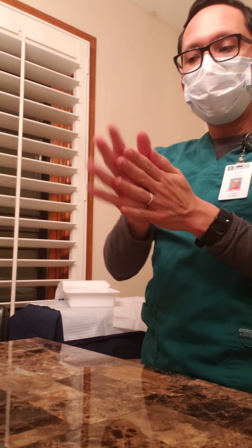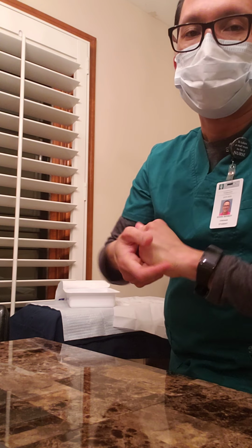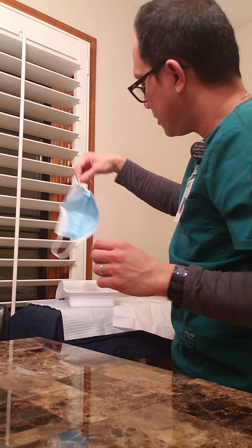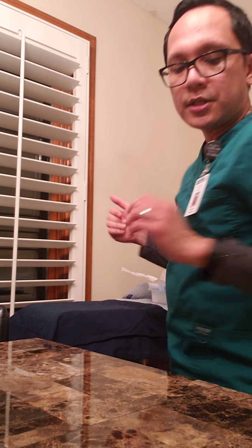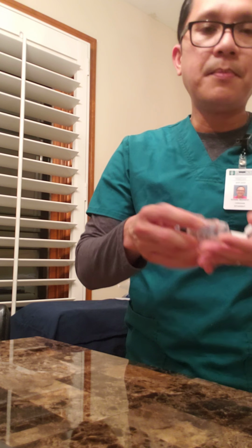At this point in time, you can gather all the supplies that you used and dump them in the proper receptacle. And of course, do hand hygiene again, just to make sure you keep your hands clean and not contaminated.